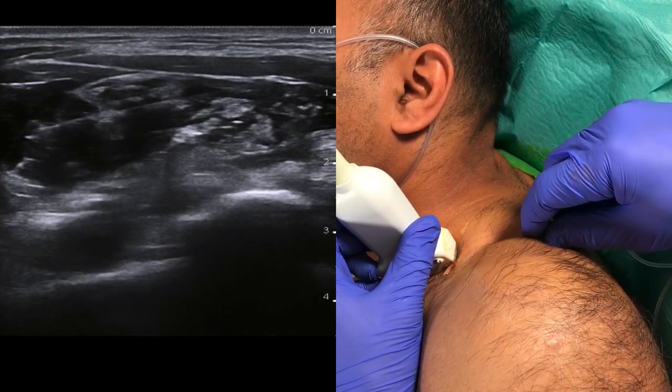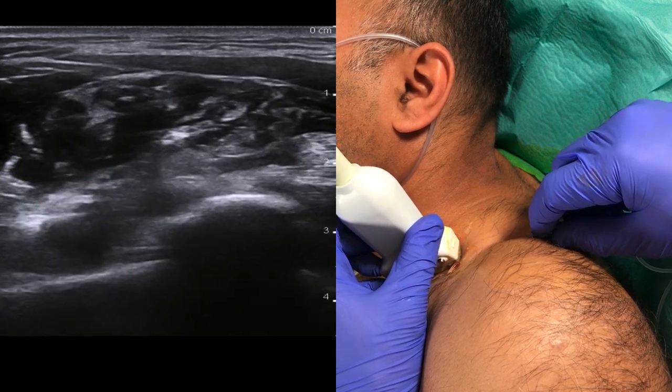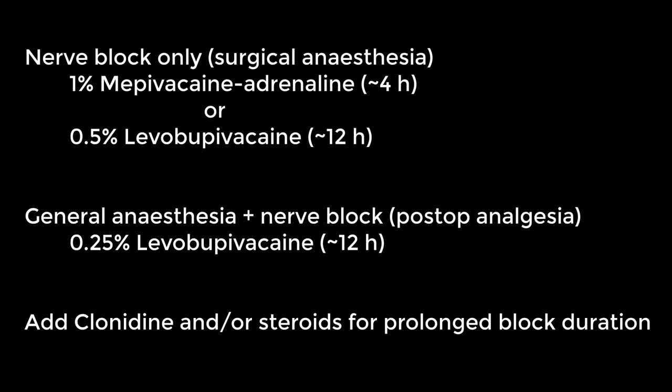Inject a total volume of 40 milliliters of local anesthetic and aim to completely surround the plexus as we've done here and marked in green. These are our suggestions for which local anesthetics to use, but take care to follow local guidelines.